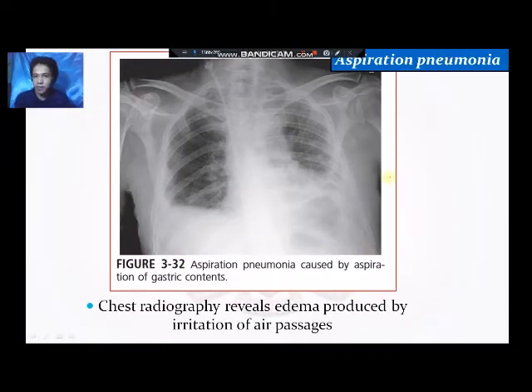So if the patient vomits and some of those materials have been aspirated towards the respiratory tract, again, no, it can cause infection or inflammation of the lung tissues. And because of the inflammation or infection of the lung tissues, later on, it may cause fluid accumulation. So same in this patient, no, who has aspiration pneumonia, or developed pneumonia because of the aspirated materials.